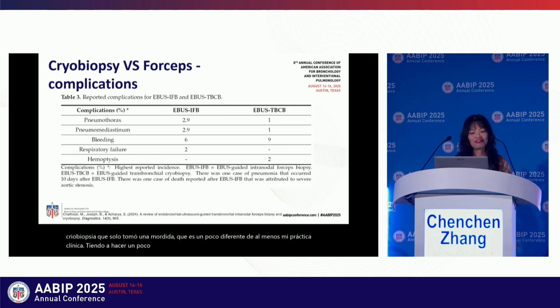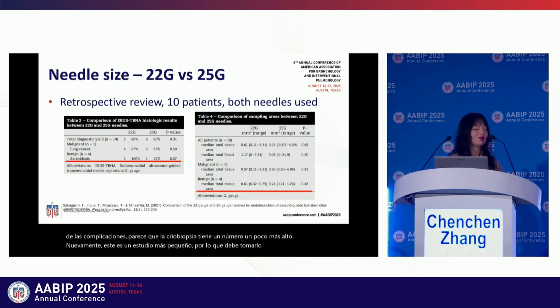So I feel this is sort of like another summary of the complications from it. Looks like the cryobiopsy does have a little bit of a higher number. Again, this is a smaller study, so you have to take it with a grain of salt. All right. Again, I feel like all the studies have shown us cryo is really your friend.